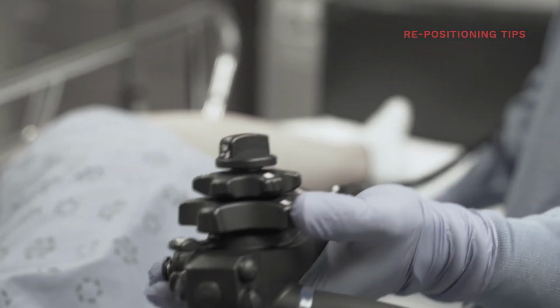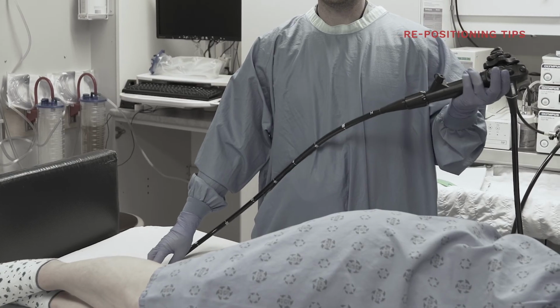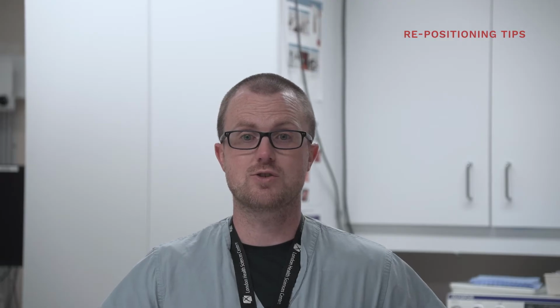As discussed, most scopes start in the left lateral decubitus position. Transitioning to supine, next, is the most common maneuver.